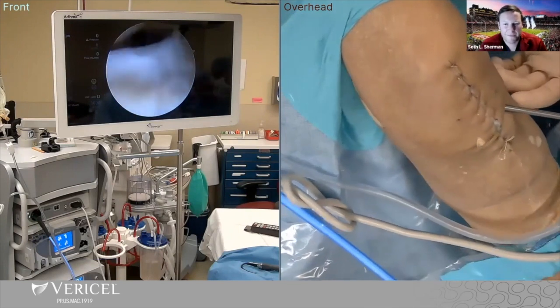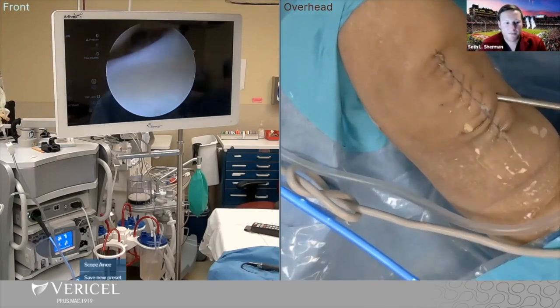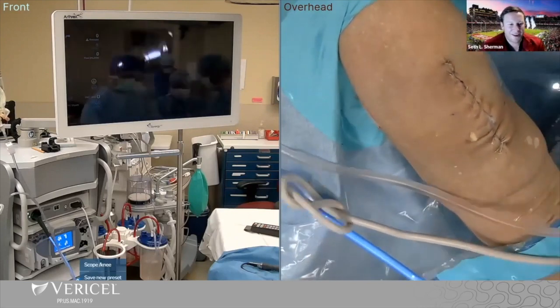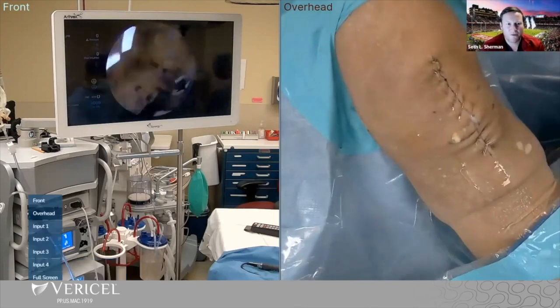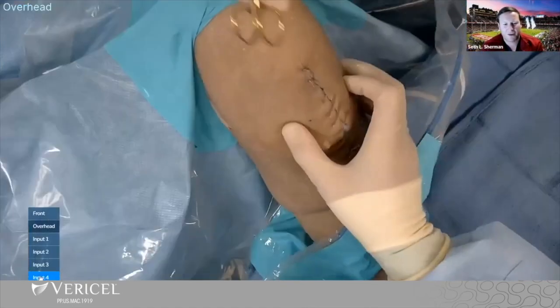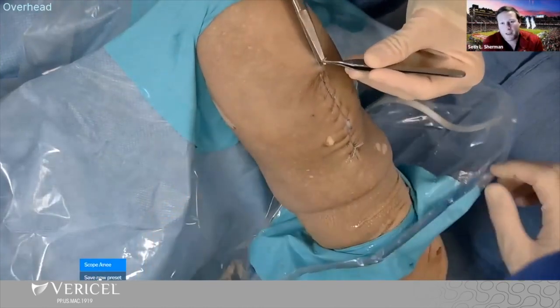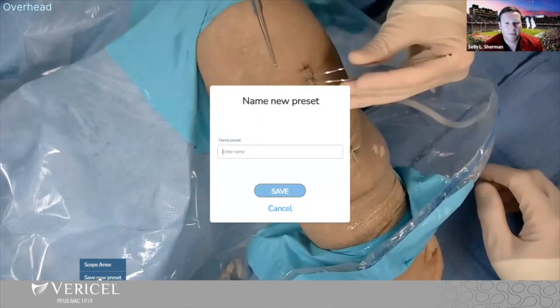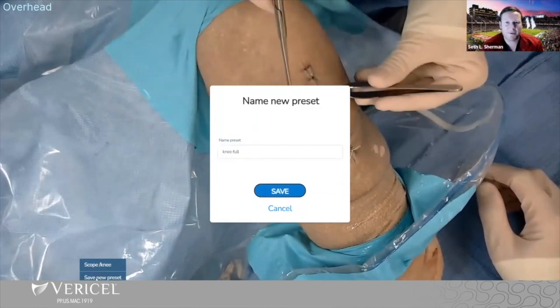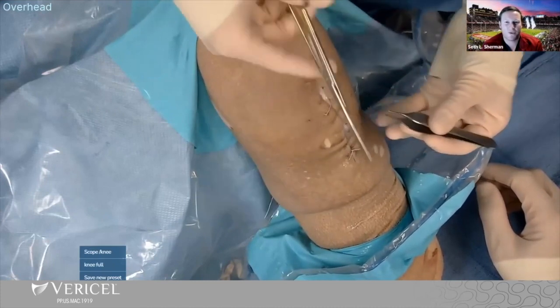So this will be straightforward, which is good for people to learn the first process. We're going to go to the open portion — we've actually made the open portion already, so it'll be a little bit faster. While you move over to the open, you talked about some metrics in the PF joint. The TTTG here we're assuming is normal, and patella height is normal. So are there any times with normal parameters that you're doing an isolated anteriorization TTO with this, or are you basing it on those measurables and not doing TTOs with these trochleas?